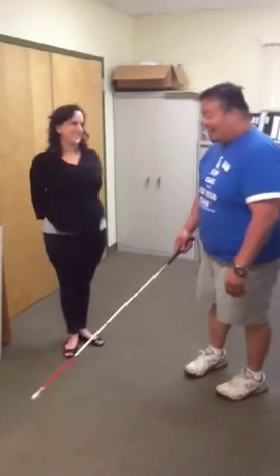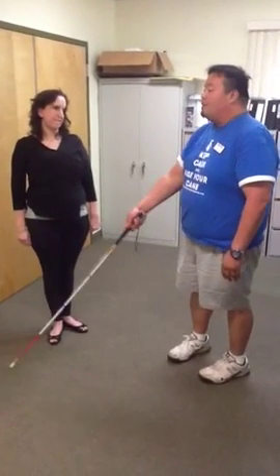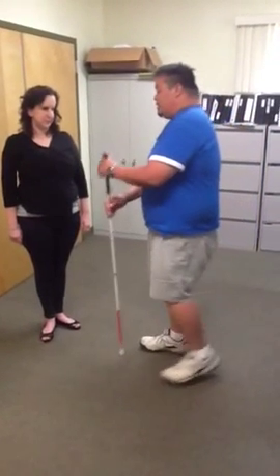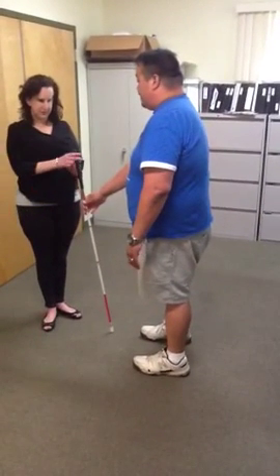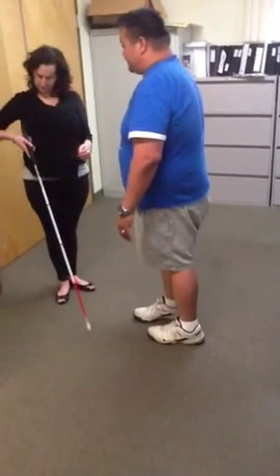Okay? And a cane is not like a seeing eye dog. It'll keep you away from trouble? No, it'll inform you of your environment around you. Okay? So the way we're going to start off is I need you to hold the cane. If you're right-handed, hold it in your right hand; left hand, left hand. So hold the cane in your hand.